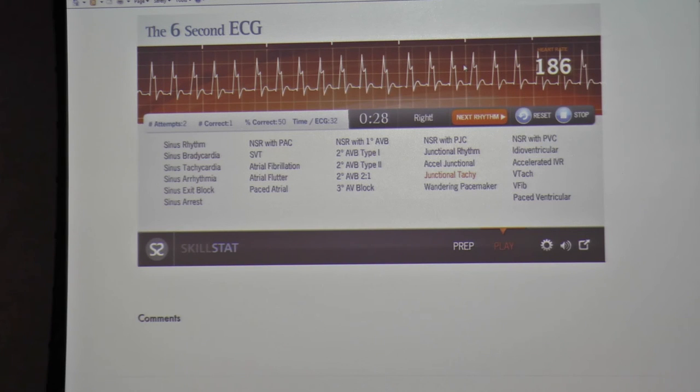The other thing it automatically also excludes you from is diagnosing a heart attack by ST elevation. Because a lot of times when they have a bundle branch block, it's going to confuse the machine and mask it, so it'd be hard to make that diagnosis. So you could always ask someone if the doctor has told them they have any kind of blocks in their heart or a bundle branch block. If they say yes, then you know it's pre-existing, it's not a problem.